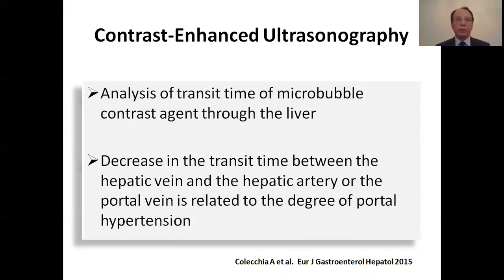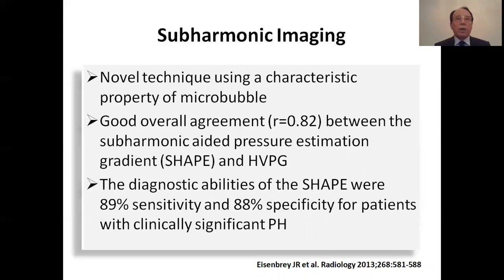It was demonstrated that decrease in the transit time between the hepatic vein and the hepatic artery or portal vein is related to the degree of portal hypertension. Subharmonic imaging is a novel technique using a characteristic property of microbubbles. There is a good overall agreement between the subharmonic aided pressure estimation gradient and hepatic vein pressure gradient.